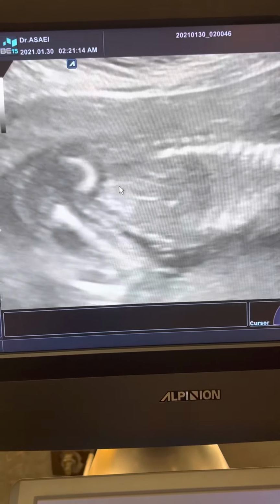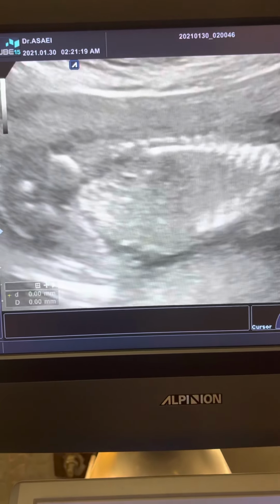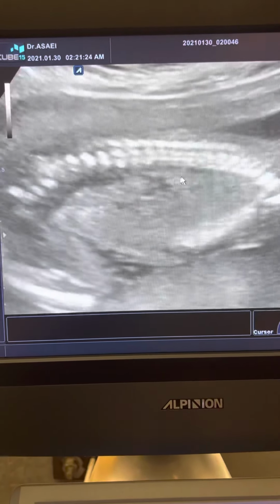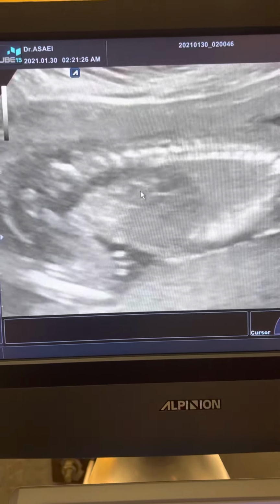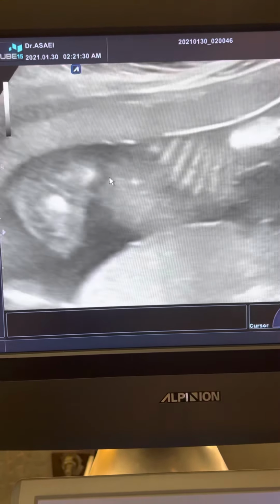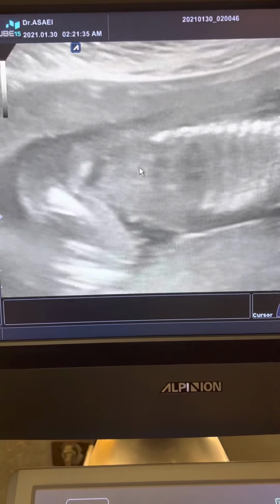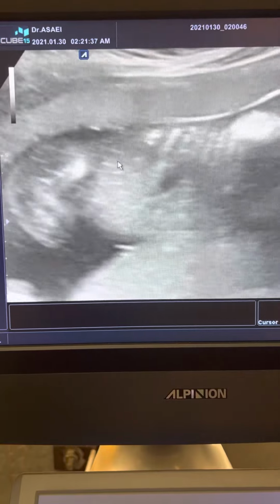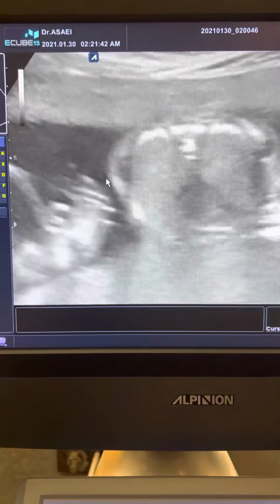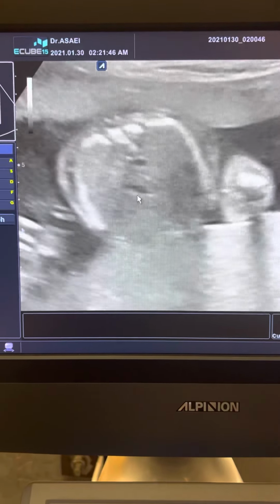Here is the right kidney. From here to here. Minimal pelvic fullness in the kidney helps us to localize the kidneys. For the size of the kidneys, we have charts, but in 18 week of gestational age, between 18 millimeter to about 24-26 millimeter is normal. We have the 4-chamber view of the heart.